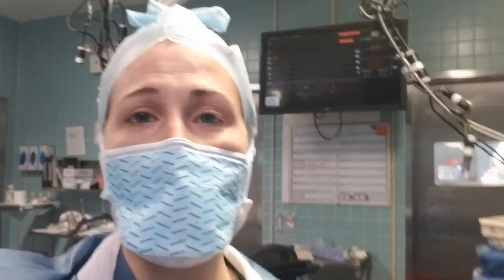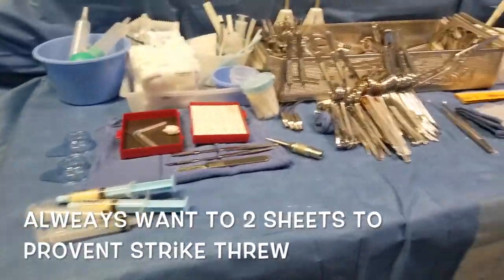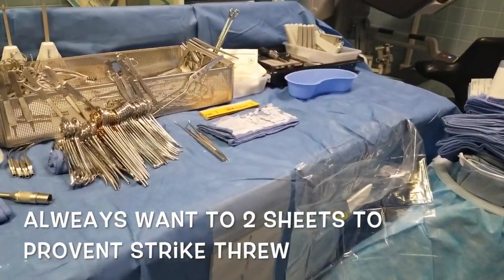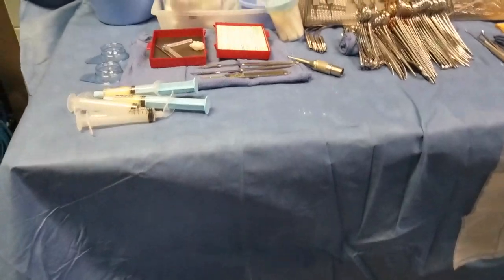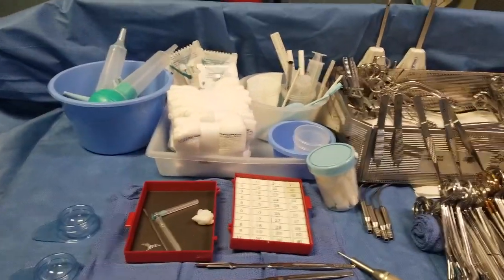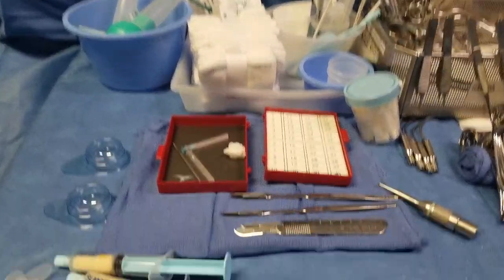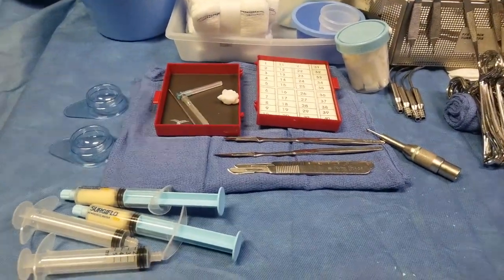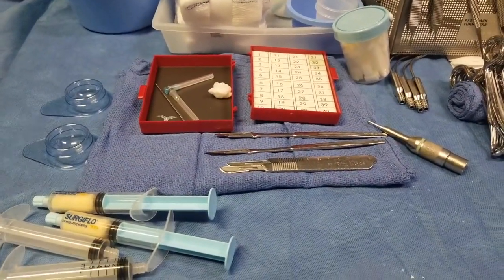For a neurosurgery setup, my back table has two sheets on top — a back sheet and another sheet. I put all my softs, my syringes, my pens, my ruler, and my sponges all in one area. Then I have a towel, and on top of that towel are all my sharps.